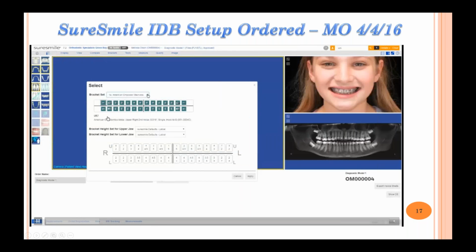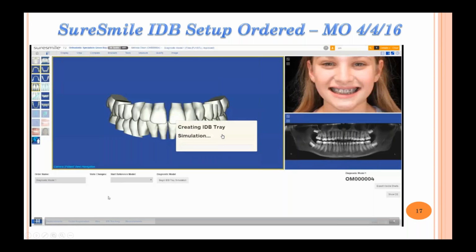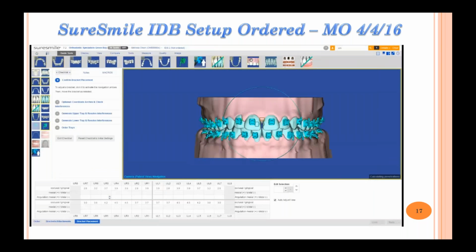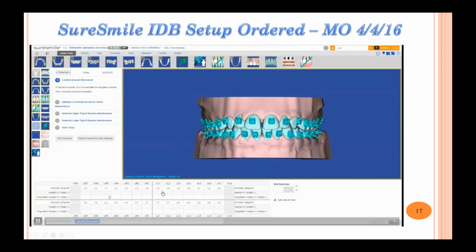You look here, there are many different types of bracket designs that you can order. We use American Empower stainless steel and clear brackets. You can set prescription heights as well. And I have set up my own vertical prescription heights. And that's customizable to anybody. And as we all know, we all like to do it differently. You can see here the setups.